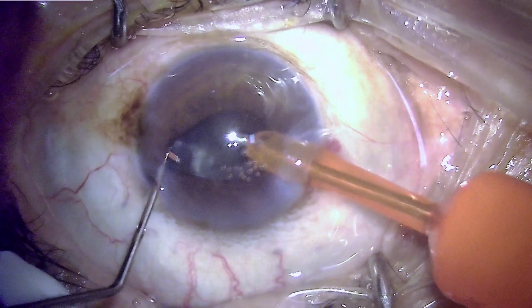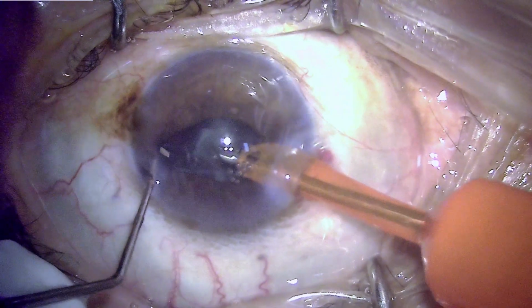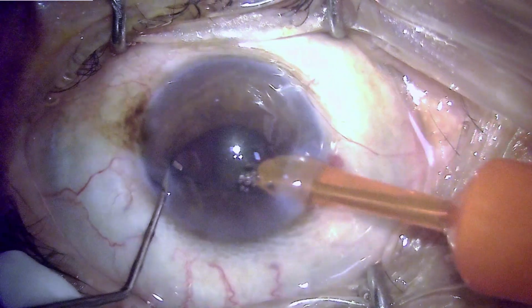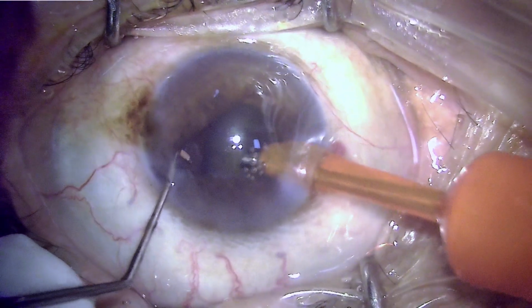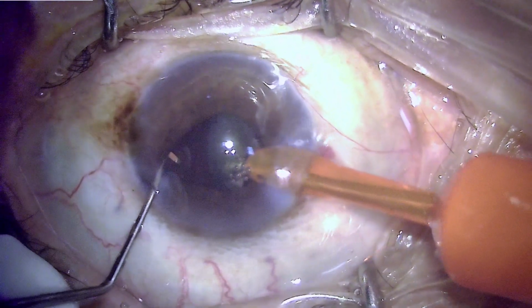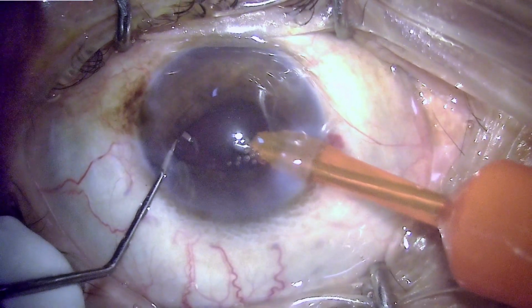We can see the major portion of the nucleus has been consumed, and this is probably the last piece, and again aligning the piece so that it is better aspirated and occlusion is achieved, so that the piece can be emulsified with an optimum amount of energy usage.